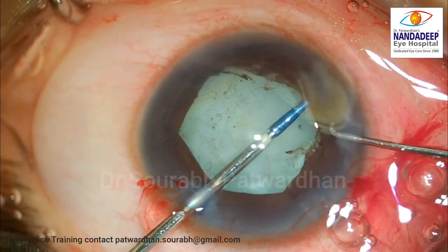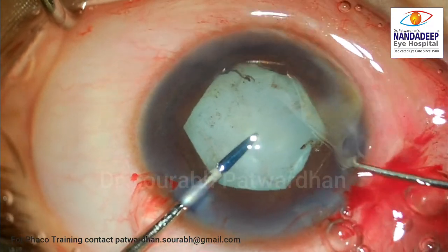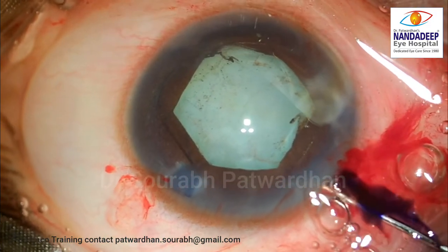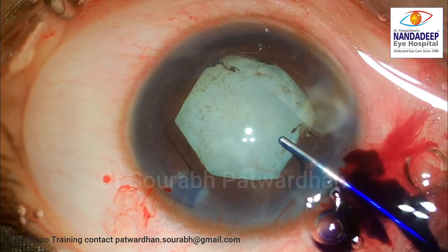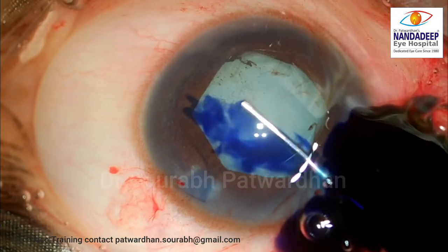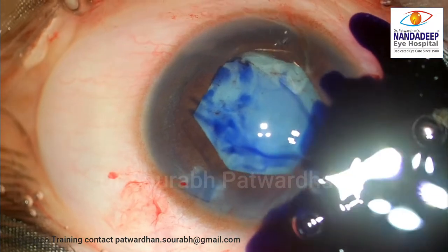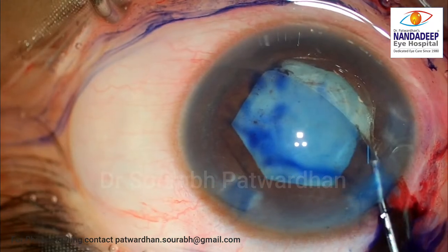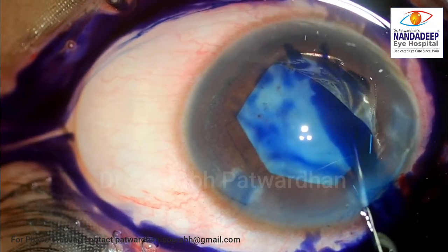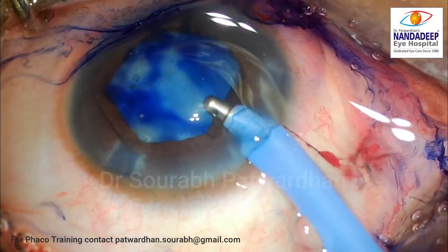You must have observed that during making of even the incisions, I had to be very careful not to touch the anterior lens surface or iris — it was that shallow. So after putting this ring and after I had removed the inflammatory membrane, I decided to stain the anterior capsule again underneath the OVD which I had already injected. The OVD I am using is a combination of hyaluronate and chondroitin sulphate, just like Viscoat. I am staining the anterior capsule because for a white cataract I need a stained capsule.